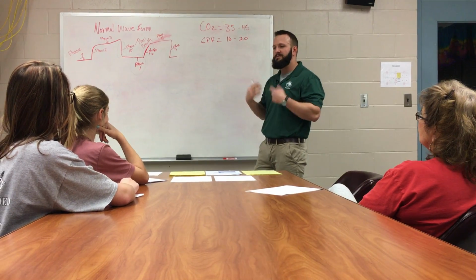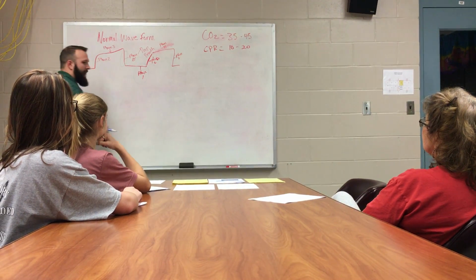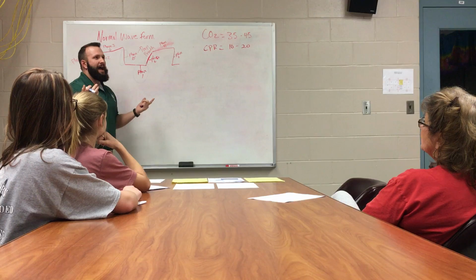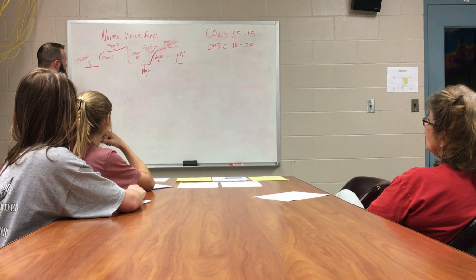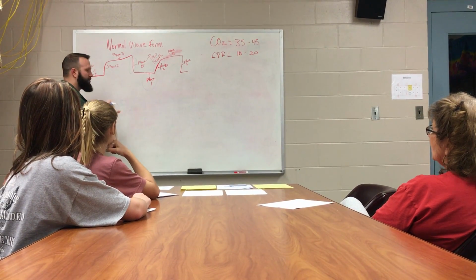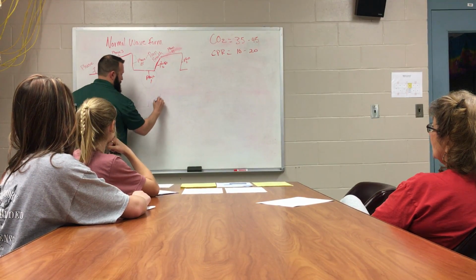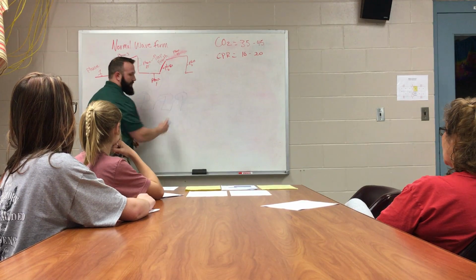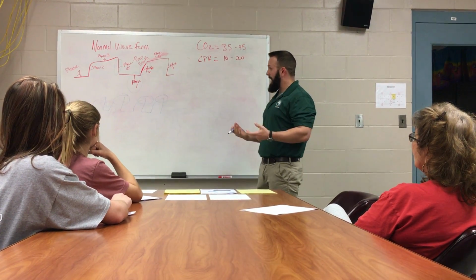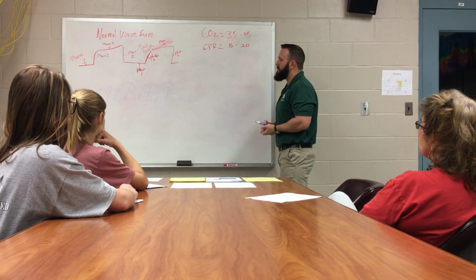So let's talk about a few problems and how the nurse can recognize these things. So I have my nasal cannula on, and let's say I have COPD. This is normal, so me and you would be normal, but now I have COPD. So my waveforms may look like what's called a shark tooth fin, a shark fin. So we're here, and we're here. And what this is, is an increase of CO2 here and here, because we all know with COPD, I can't expel my CO2 as well as a normal person would because I have air trapping. My alveoli sacs are expanded much larger than they should be, so I have a buildup of CO2.